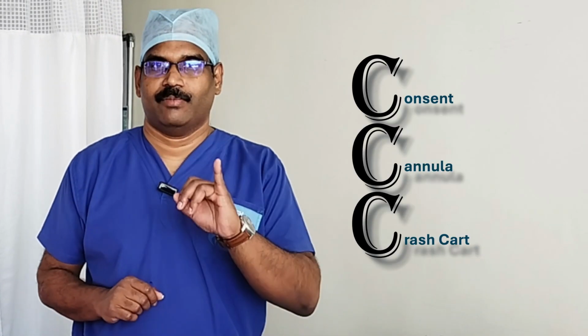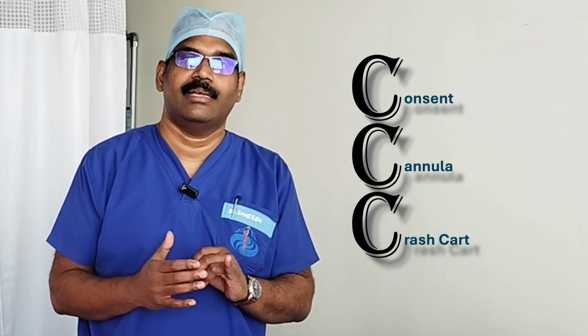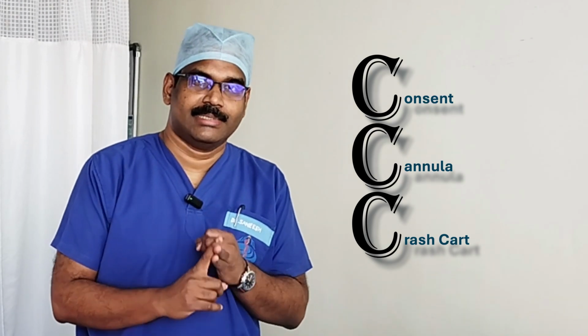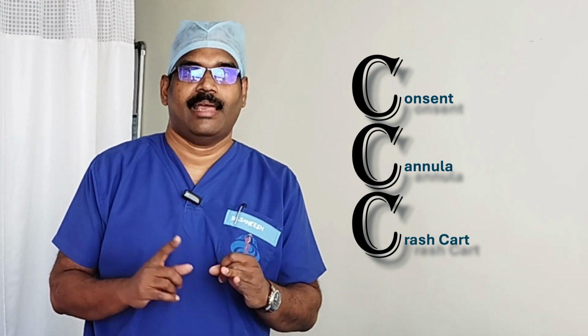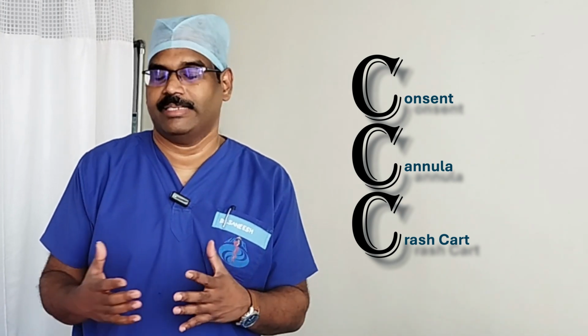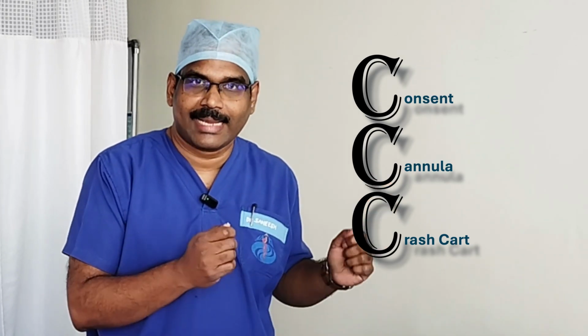So the basic steps of cardioversion are 3 C's, 3 S's. One is consent. At least a verbal consent from the patient and the bystander should be taken as far as possible. Second C is cannula. You need to administer IV medications, and maybe the patient might become more unstable after your intervention. So cannula is a must. Then you should bring in the crash cart.